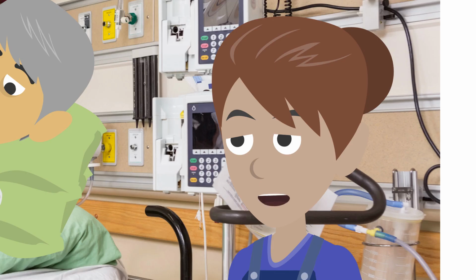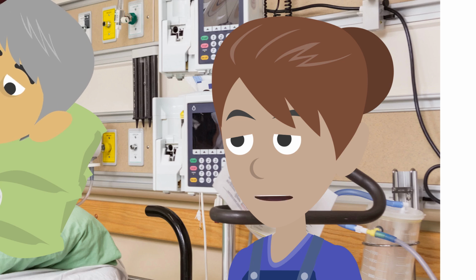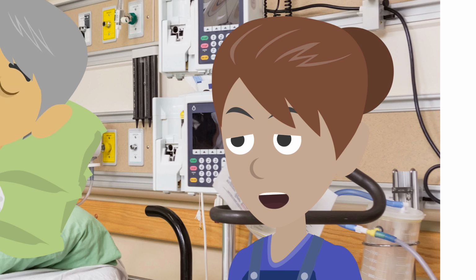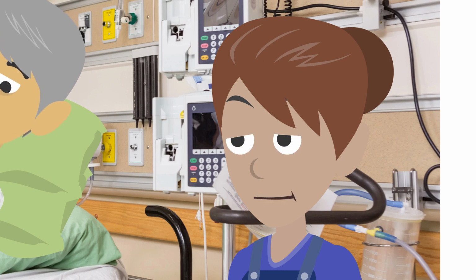All right. I'm going to put in the tube and slide it along the floor of your nose. The tube will go to the back of your throat. Try to relax if you can. If I feel any obstruction, I'll stop and try the other nostril. I know it's not pleasant, but try to swallow the tube as it passes through the back of your throat into your esophagus. Remember to put your hand up if you need a break.